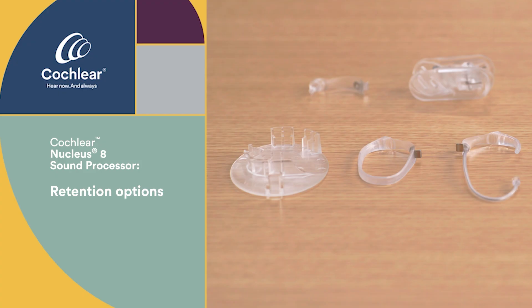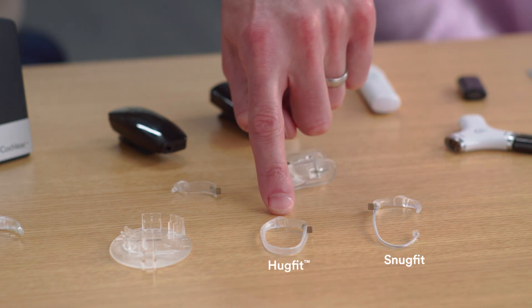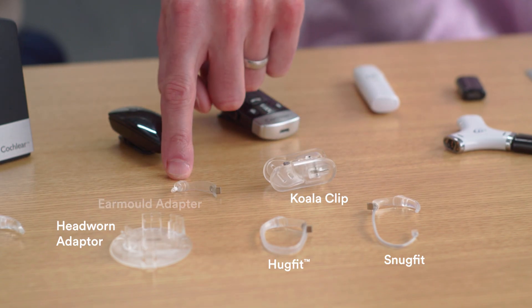Whether you're an adult or a pediatric recipient, we offer many retention options: the SnugFit earhook for added behind-the-ear retention, the HugFit earhook for 360-degree behind-the-ear retention, the head-worn adapter which converts the Nucleus 8 to an off-the-ear wearing option, a koala clip for clipping to your shirt, as well as an earmold adapter.